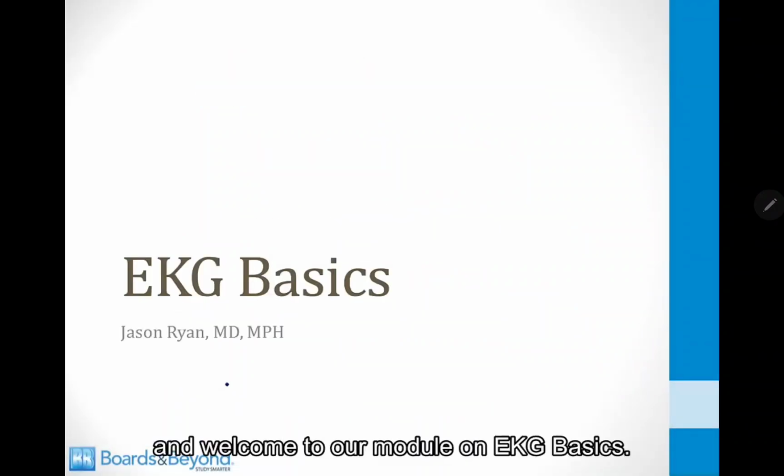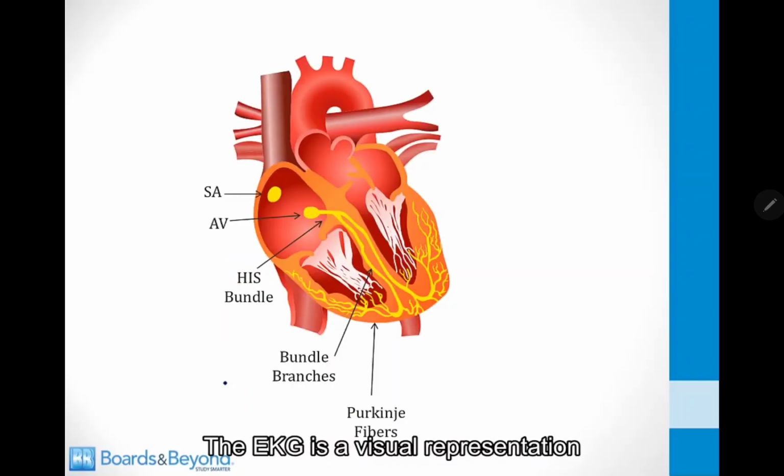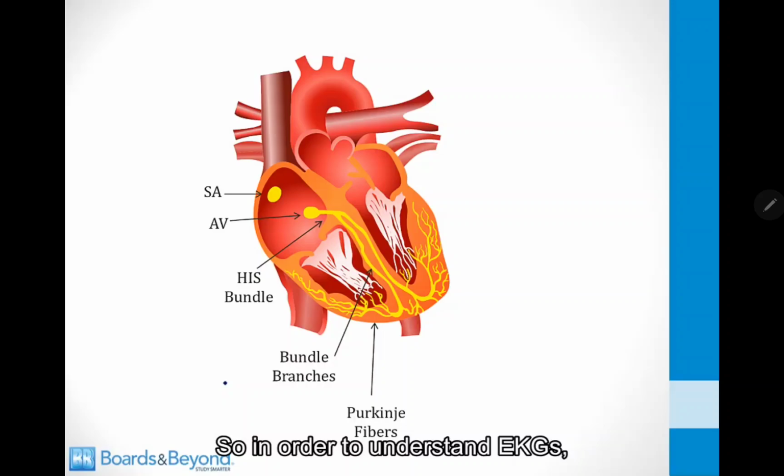Hello everyone and welcome to our module on EKG basics. The EKG is a visual representation of electrical activity as it moves through the heart. So in order to understand EKGs, we need to review how electricity moves through the heart under normal conditions.